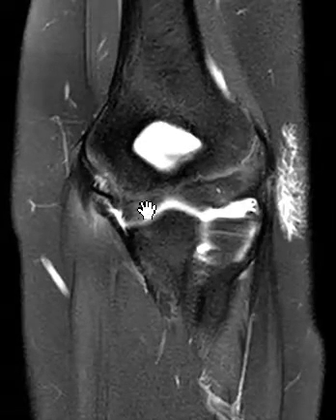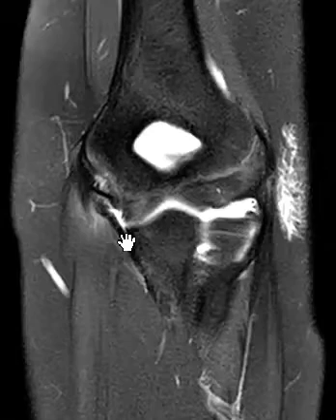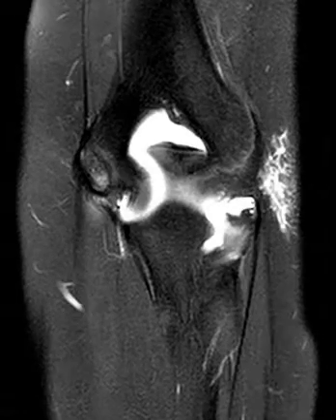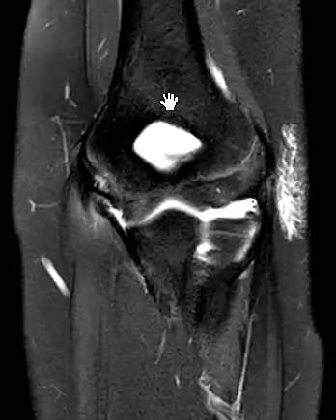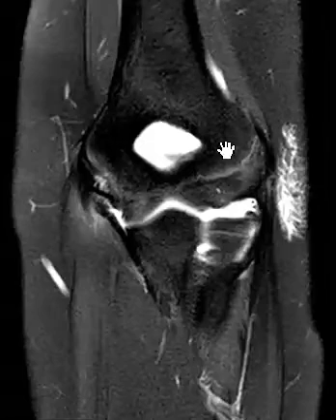Now we're going to take our attention over to here. This linear band is the ulnar collateral ligament. It attaches from the ulna here up to the humerus here. This bony protuberance is the medial epicondyle. In this view, marrow should be dark — like right here. Fat is suppressed; this is subcutaneous fat that's dark. Marrow is dark.